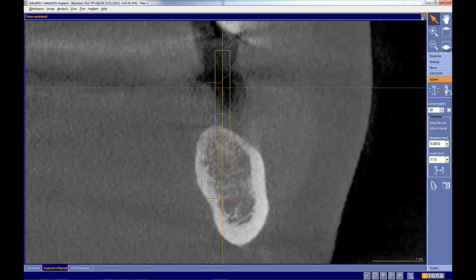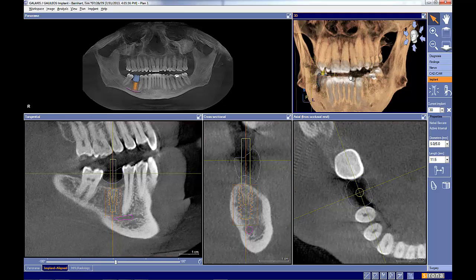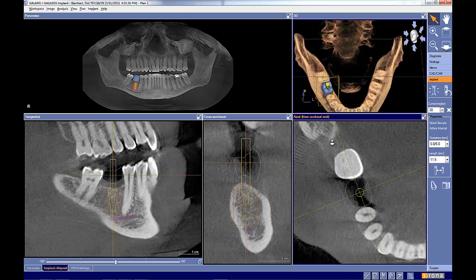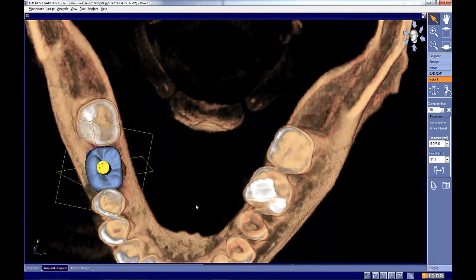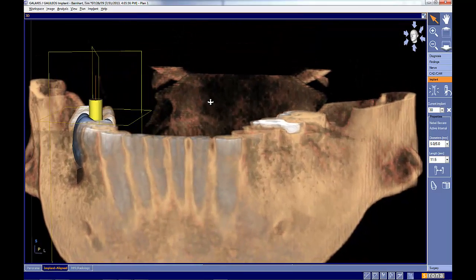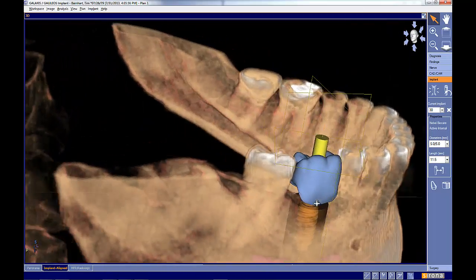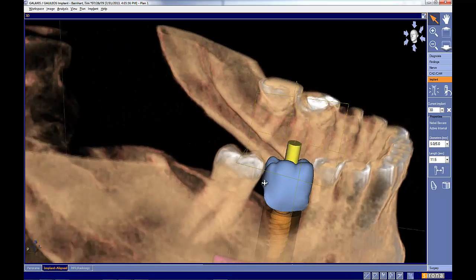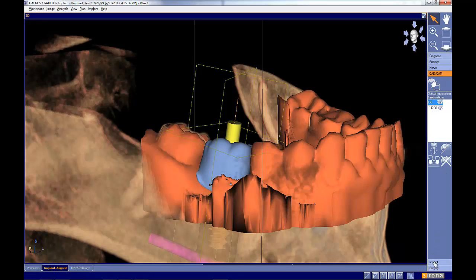So again, everything looks very good. The last thing I just like to check is let's go over here and clip along the active slice, and we'll take a look at our case right here. And again, the only thing I can say if we look at it from this angle is not much here. Again, I'm a little concerned if that buccal margin was drawn too apical. That may be the case. Let's see here if we show it there. Will we get a better view of it?